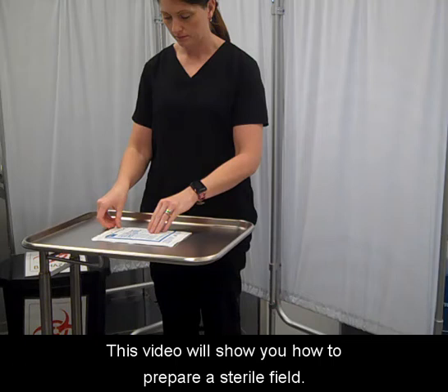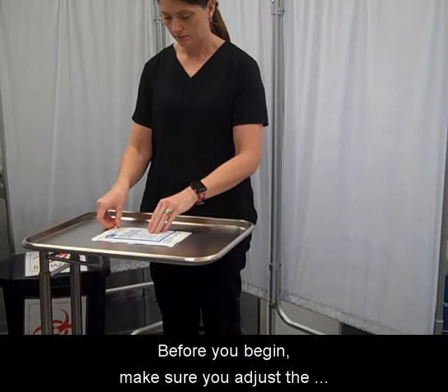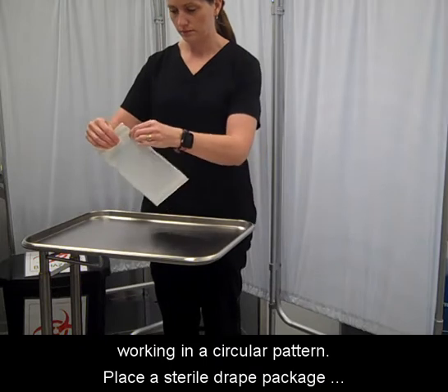This video will show you how to prepare a sterile field. Before you begin, make sure you adjust the height of the mayo tray so that the stand is at waist level. Clean the mayo tray starting from the center and working in a circular pattern.